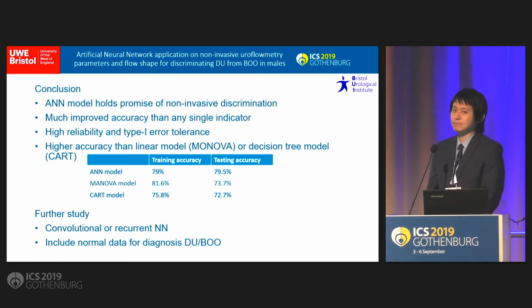The one thing I would suggest as next step, rather than what you're proposing down there, is if your model works quite well on uroflow done in your institution, to convince me that whatever you're doing, what I don't understand, is real, take uroflow data from someone outside your institution, especially just a normal doctor's office.